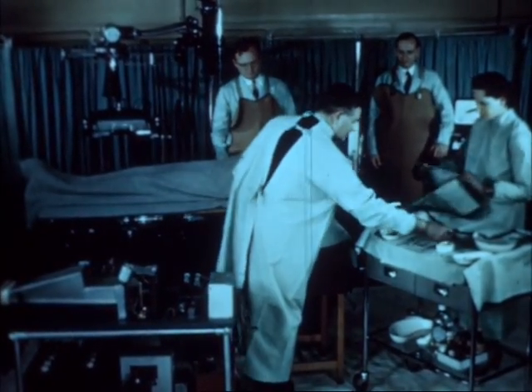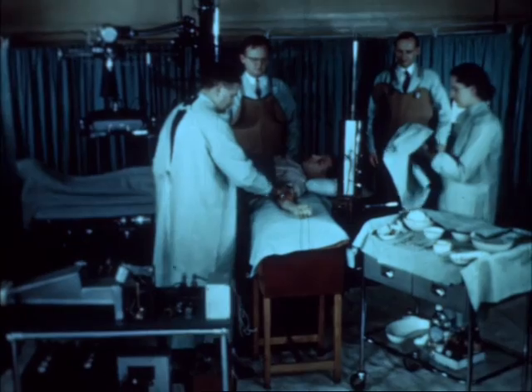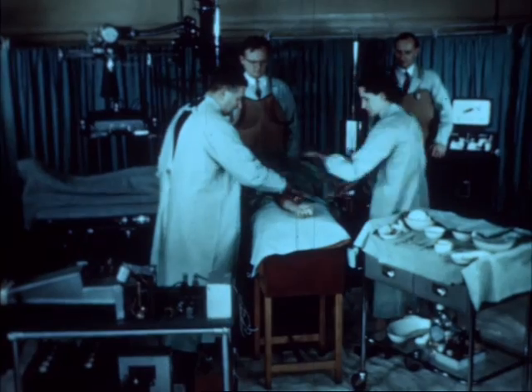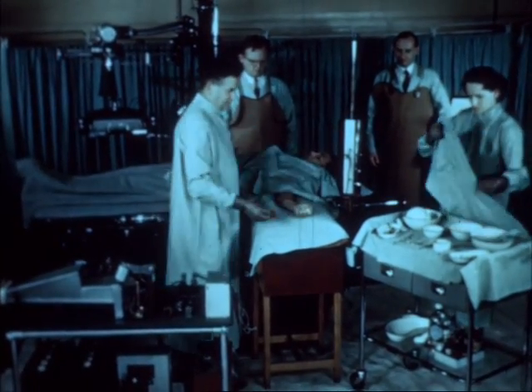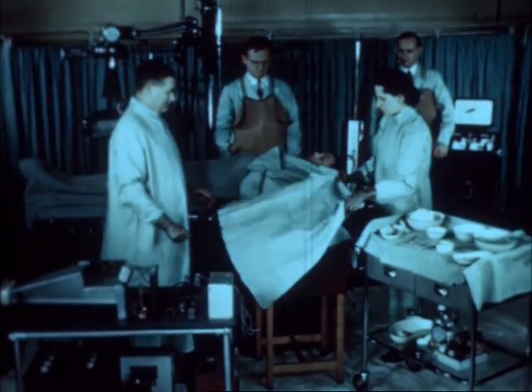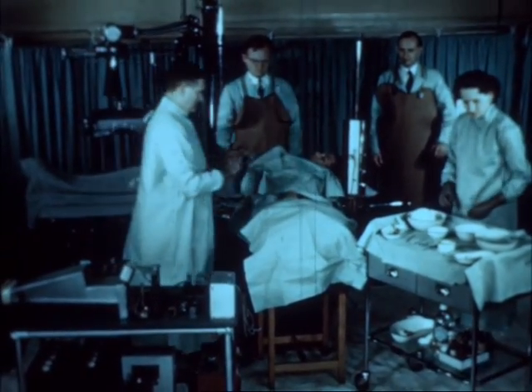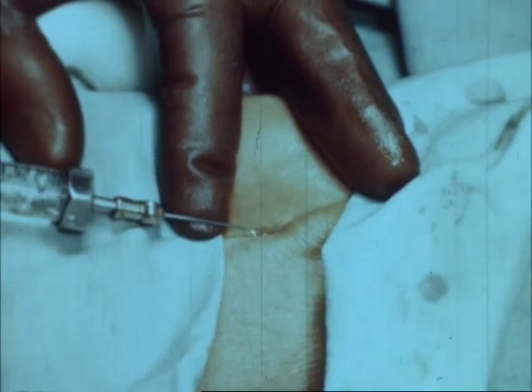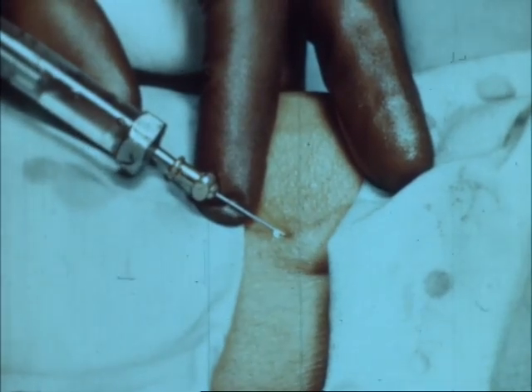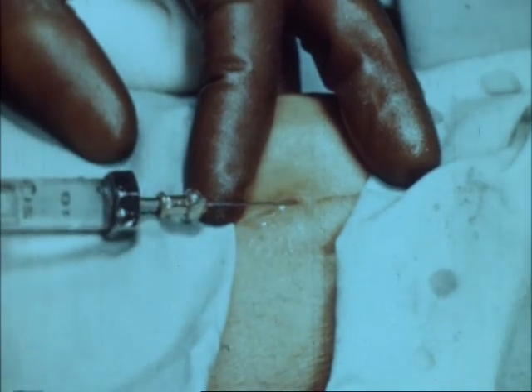We proceed to prepare the arm of our patient for the insertion of the catheter. The possibility of leaving a cardiac catheter in position for a sufficient length of time to make serial observations on the behavior of the heart was first realized by Dr. André Cournand and his colleagues, who published their method in 1941. A local anesthetic, in this case 2% procaine solution, is injected into the skin and subcutaneous tissues over and around the median basilic vein at the bend of the elbow.